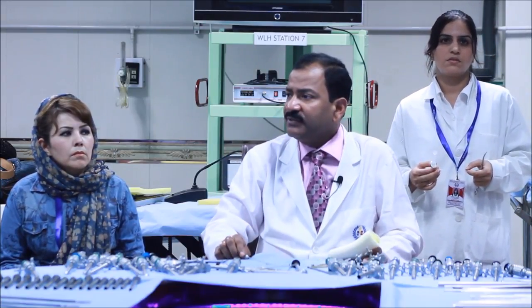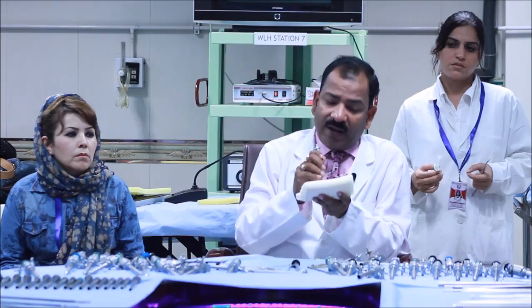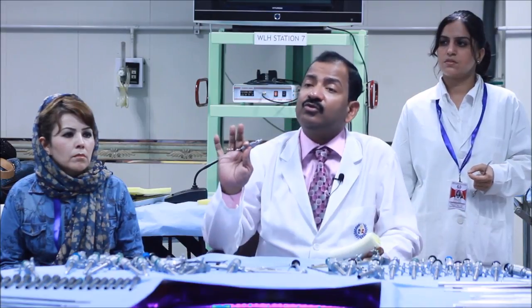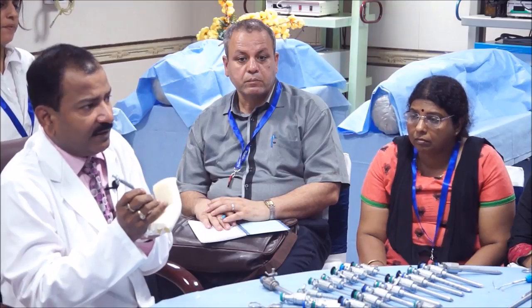All of you might have gone a couple of times to the preperitoneal space, because we are hesitant, especially the beginners, and you are going oblique. So, this is a big problem. So, what to do? If I am going oblique, I am going to the preperitoneum. If I am going perpendicular, I am at risk. The better way is, you should go oblique as well as perpendicular, both. So, you lift the abdominal wall in such a way that the angle between the Veress needle and the abdominal wall is 90 degrees. But the angle between the Veress needle and the body of the patient is 45 degrees. So, both your problems are solved.